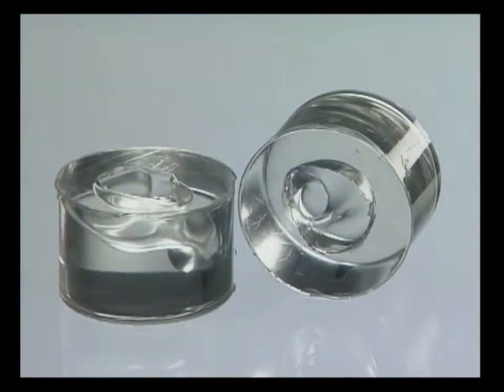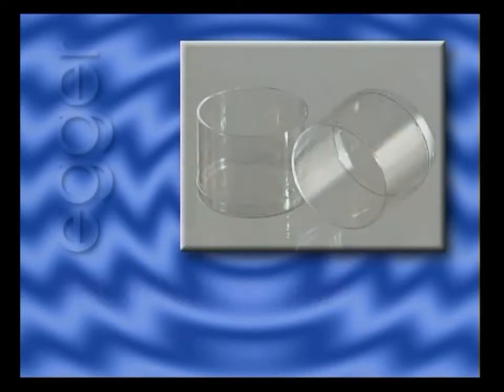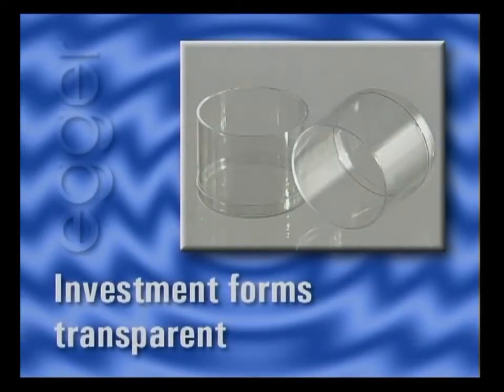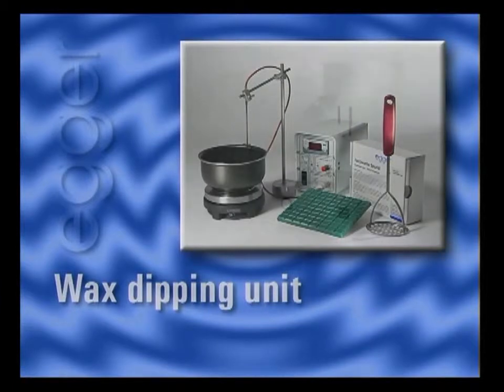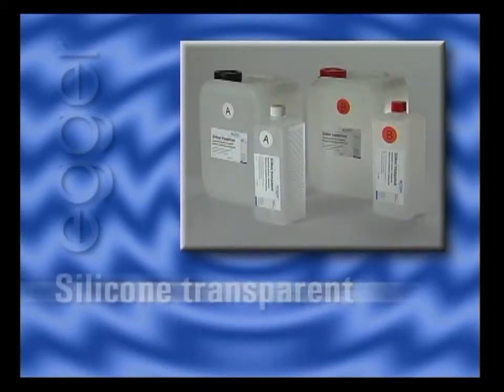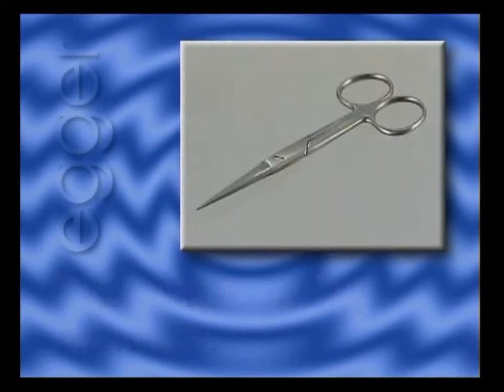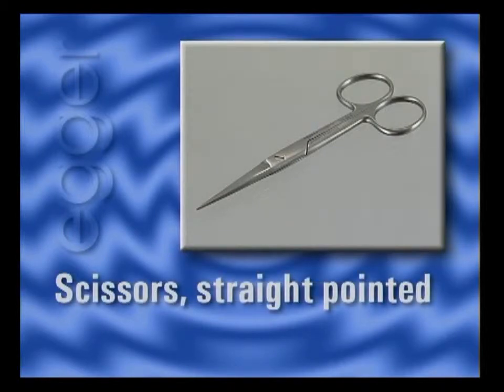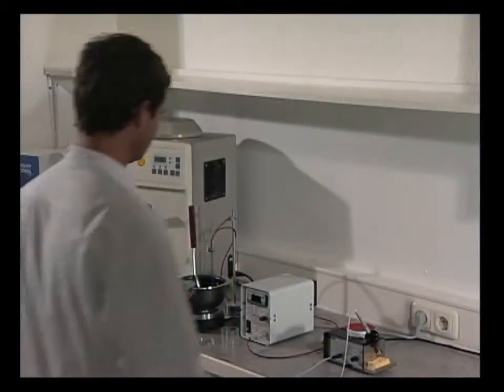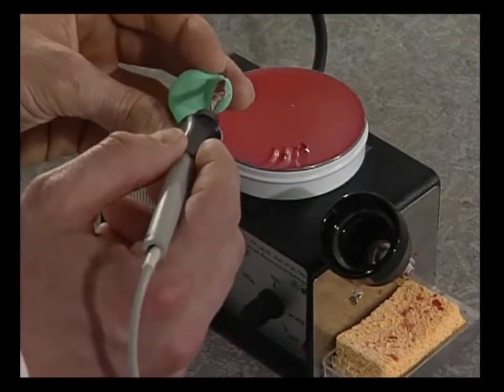Transparent silicone control forms are produced for ITE shells made of light polymers. The electric wax knife is used to correct inaccuracies on the impression with red correcting wax.